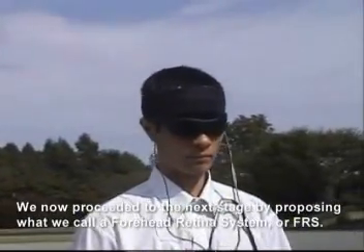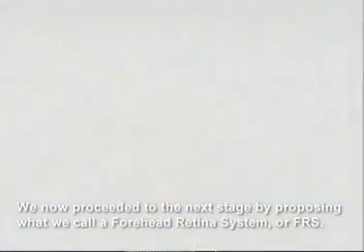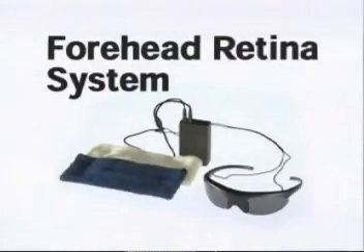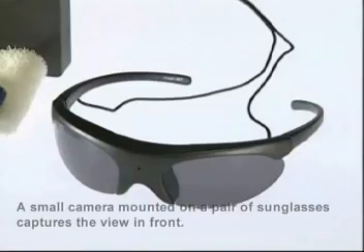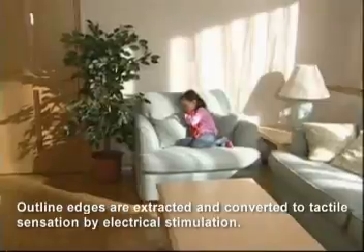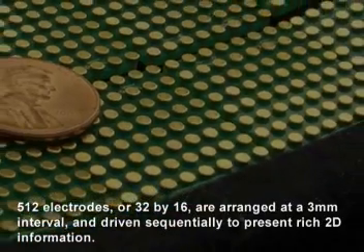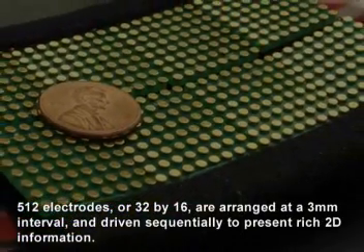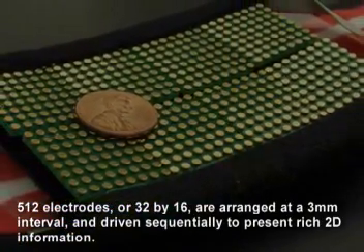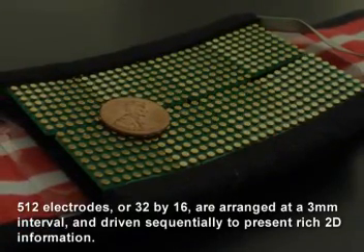We now proceed to the next stage by proposing what we call a forehead-retina system, or FRS. A small camera mounted on a pair of sunglasses captures the view in front. Outline edges are extracted and converted to tactile sensation by electrical stimulation. 512 electrodes, arranged in a 32x16 grid at a 3mm interval, are driven sequentially to present rich 2D information.